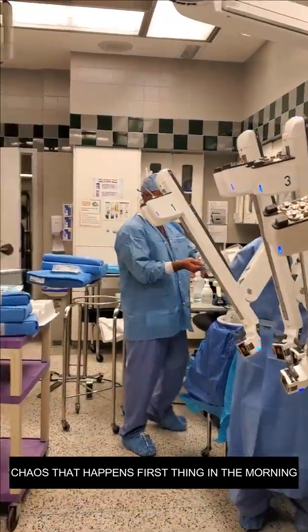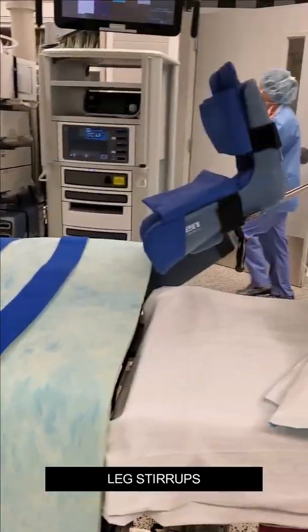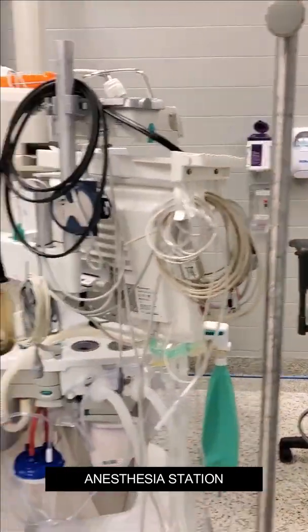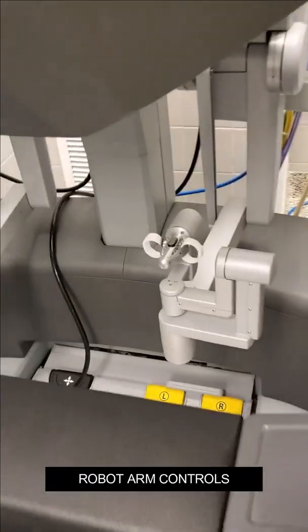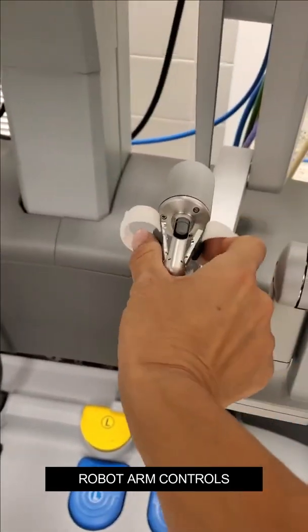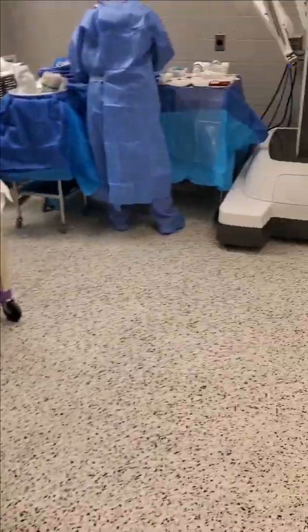Here's the chaos that happens first thing in the morning — this is our setup. This is the bed; that thing there is for legs. Anesthesia sits there. This is my console, this is where I control the robot. These little arms right here are where I put my fingers and I basically manipulate the robot arms. That's our 3D viewer, so you're looking into there — it almost looks like you're playing a video game, or it feels like you're actually inside of the patient.